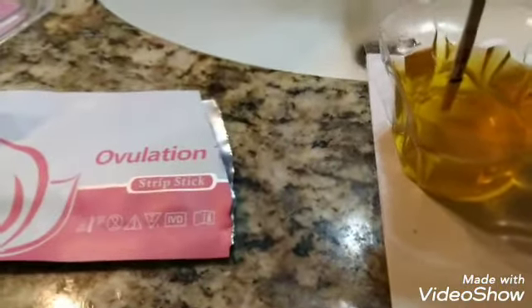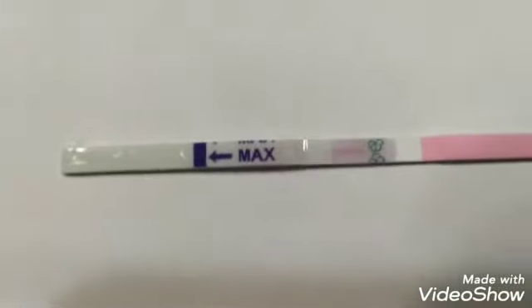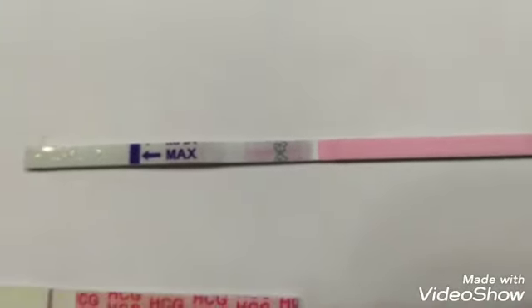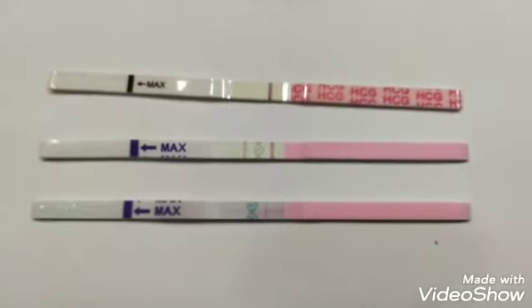So I'm going to do my 10 to 15 second dip. 1, 2, 3, 4, 5, 6, 7, 8, 9, 10, 11, 12, 13, 14, 15. And I can see it already moving across. There's my little flower that just popped up. And the control should be coming up soon. So I'm going to let that simmer. You can see the control line next to the flower is kind of coming up. See if I can move this without too much emotional damage to put it under the other one over here, and get this pee out of the way. So there's my control line. You can see it already coming in. And I will be back in about 10 minutes, as they say.